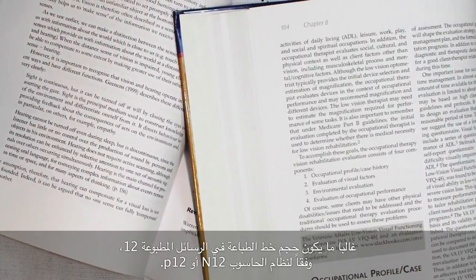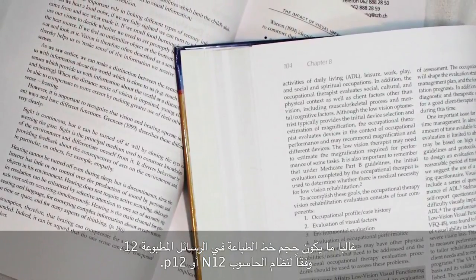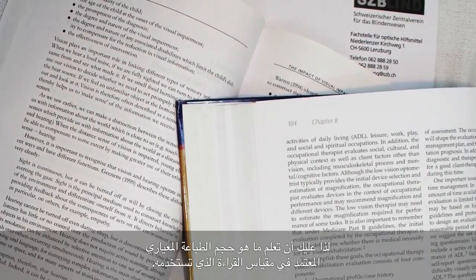Now, standard print in letters is often printed in font 12 on a computer, or N12 or P12 on that scale. You need to know what standard print is on the reading scale that you use. Now, what we have to do is compare the measured size of the reading text that the patient can manage with the size of the text that they want to be able to read. An estimate of the magnification needed is a simple ratio between these two numbers.